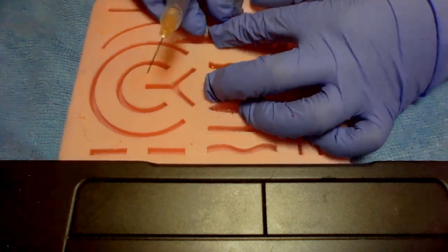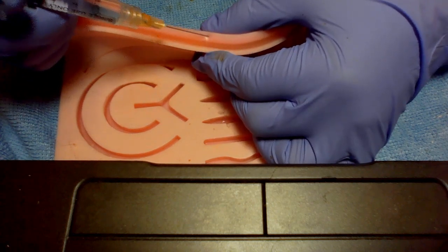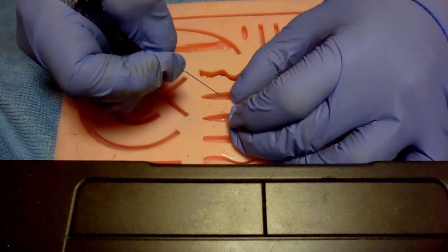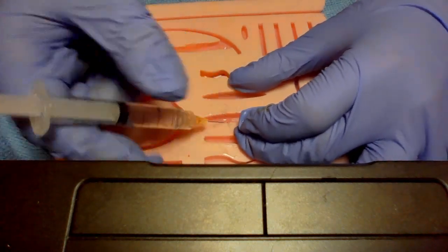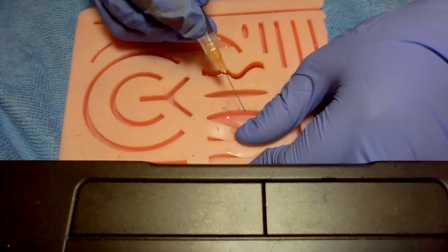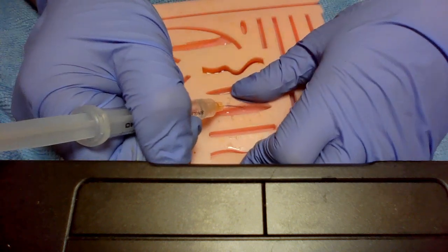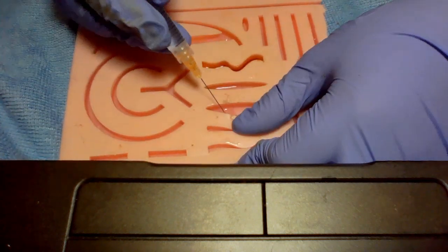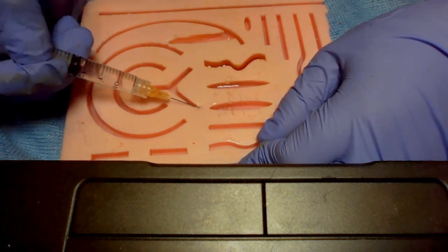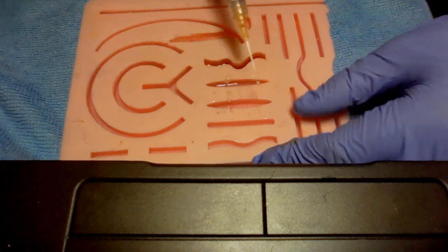Now, if we were going to do a subcutaneous fat anesthetization, this is the subcutaneous fat right here. This little white part, that's what that pink part resembles. We would go in at the subcutaneous fat level in the wound, and if we're anesthetizing, we'll go in from the side like that to make sure it's anesthetized.